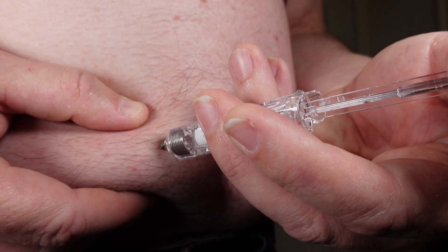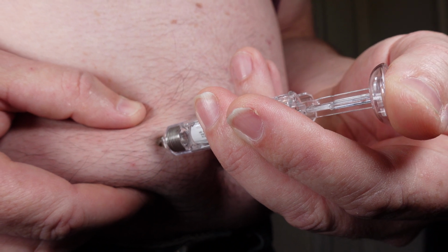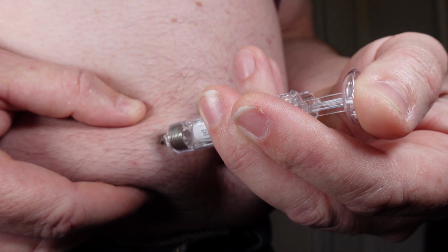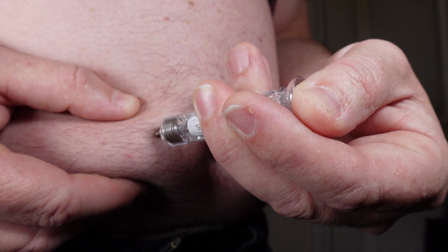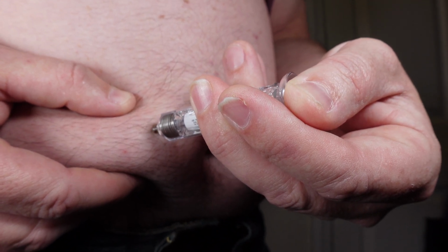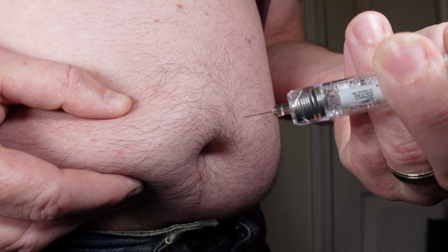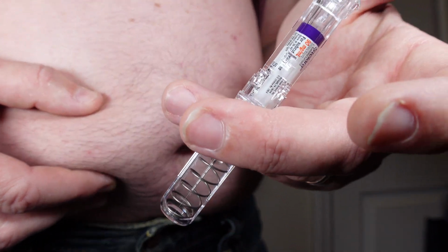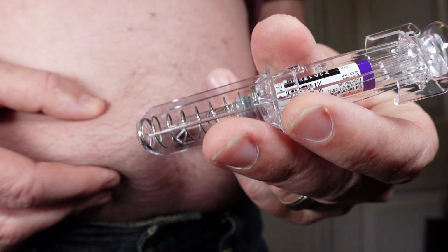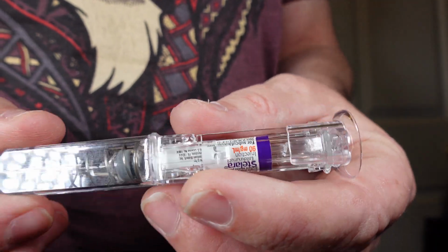Use your thumb to go ahead and push down on the plunger to inject the medication. Once the plunger is all the way in and all the medication's been injected, wait a second or two to make sure everything goes in, and then go ahead and pull out the needle. Once you pull out the needle, remove your thumb from the plunger, and you'll see that the needle self-retracts into the syringe housing. And that's it. The process is complete, except one more thing.